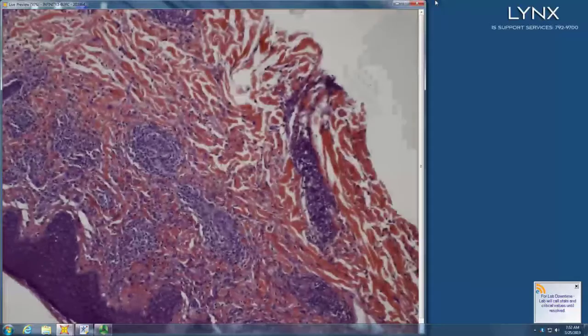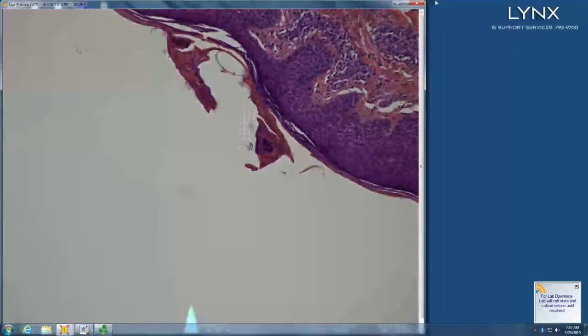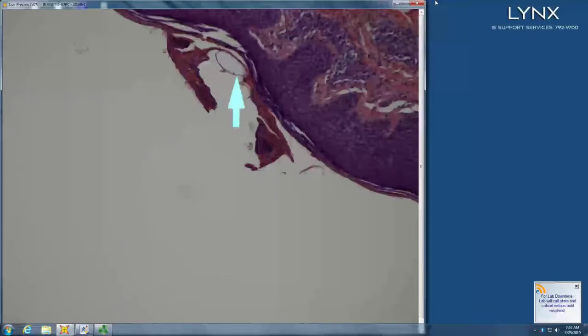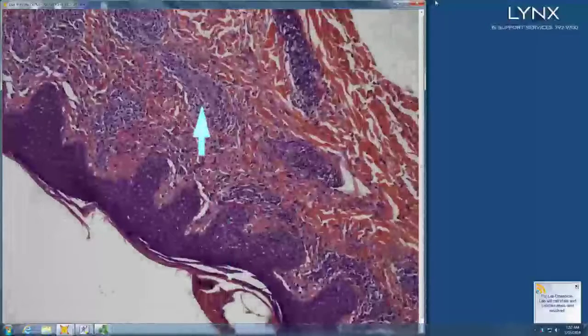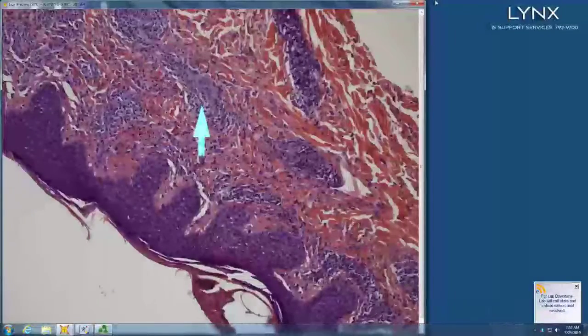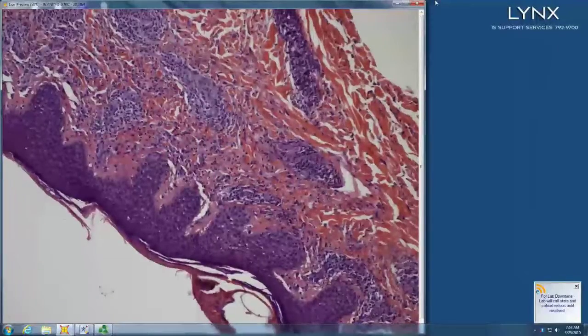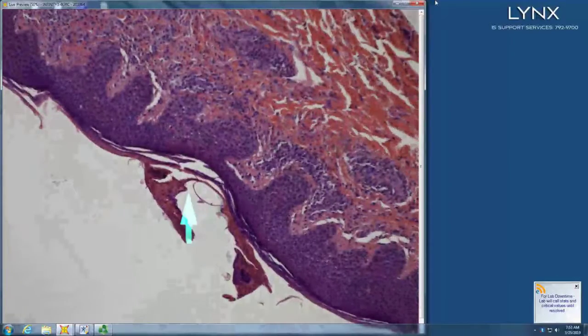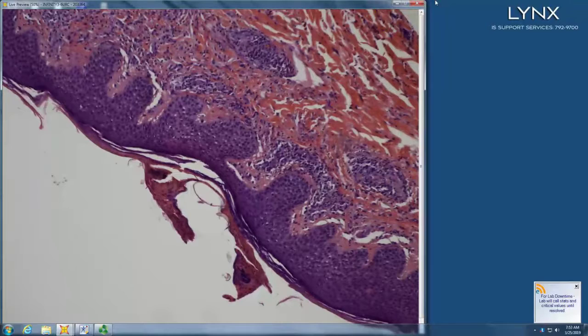Cut deeper, looking for scabies. And you don't have to cut deeper. You're already there, right? So the dermis looks like arthropod reaction, right? It looks like a bite. Endothelial swelling, polymorphous infiltrate, lots of EOs, and the reason we say arthropod is it could be a bite, could be a sting, could be an infestation.